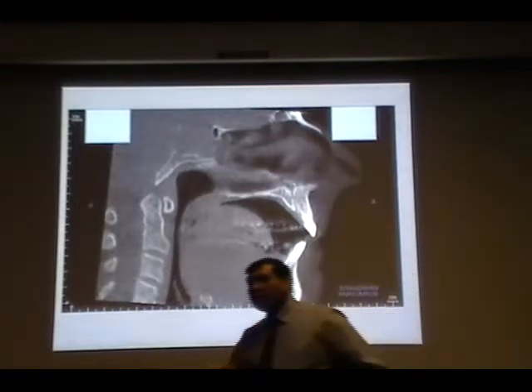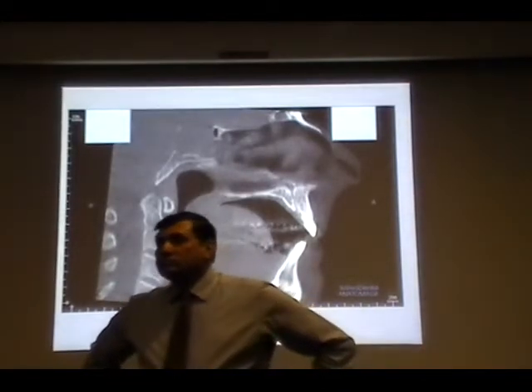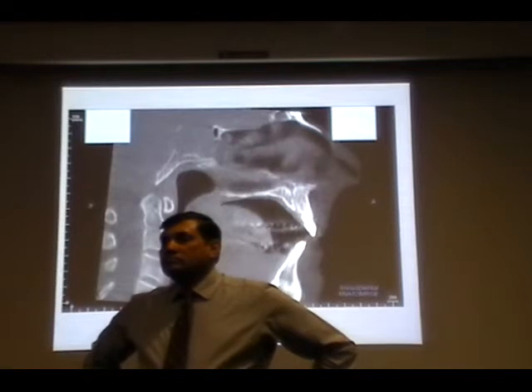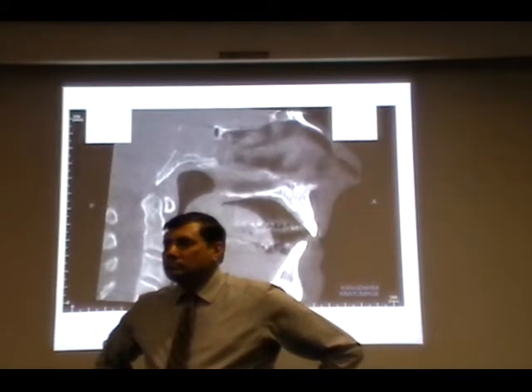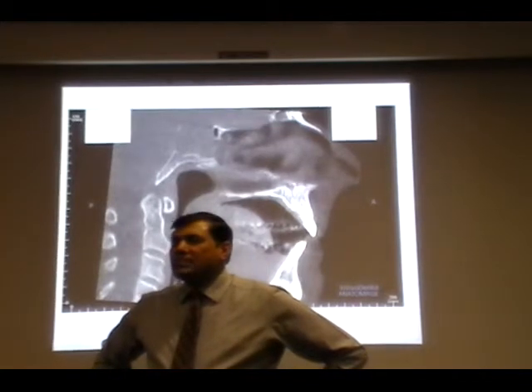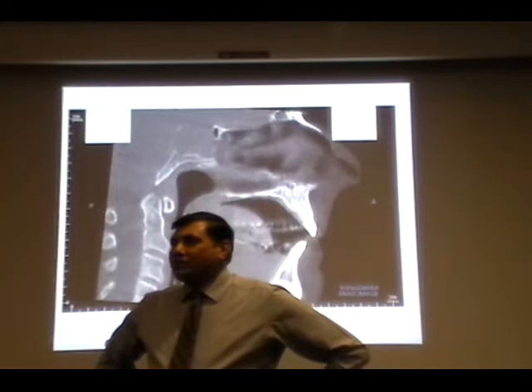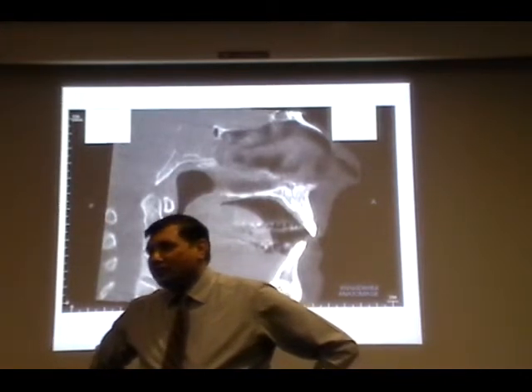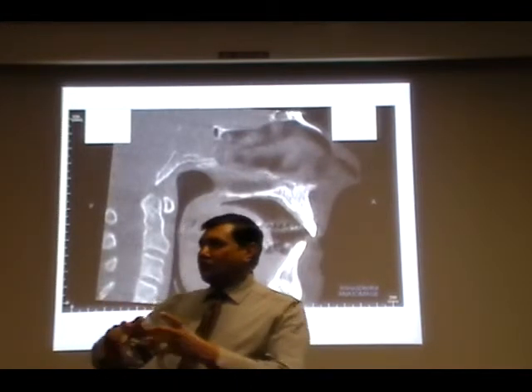How can we take the slice without anything blocking in the middle? Where do you put the source and the receptor so that you can slice just one piece, and the posterior teeth are not blocking it? We need to go and read more about it. There's something called back projection geometry, so how these computers work to get a good image.